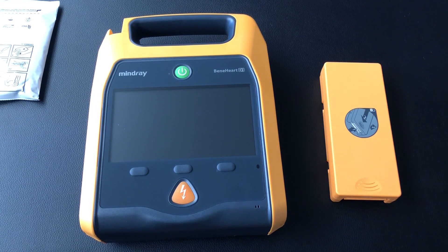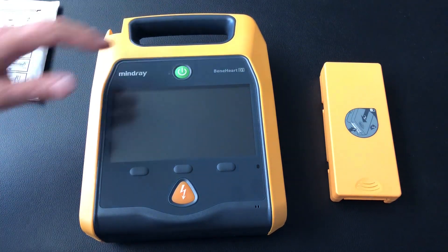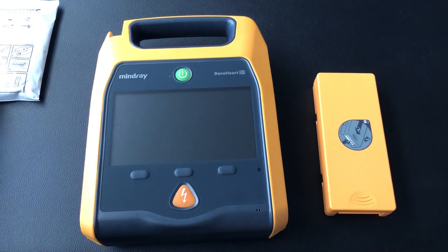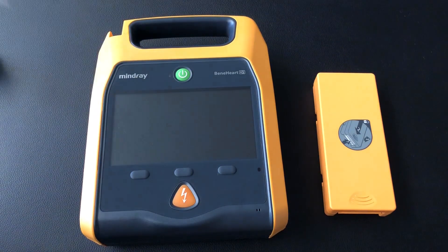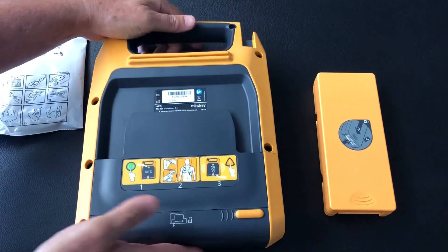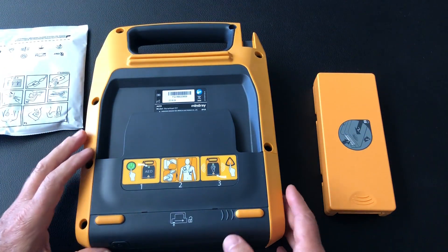Hello, this is Phil from HeartSafe Medical Solutions with a quick startup video on how to set up your new Mindray D1 defibrillator. First thing we do is after unpacking the battery, the defibrillator and the pads, we turn the defibrillator over and we remove the battery housing.